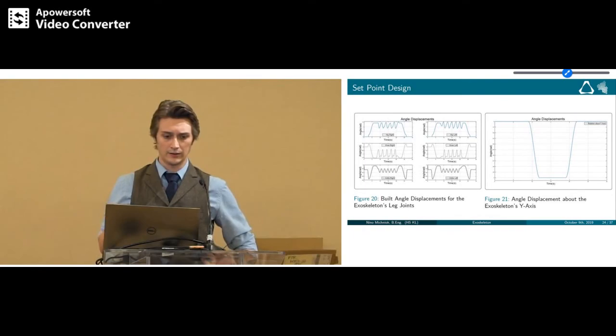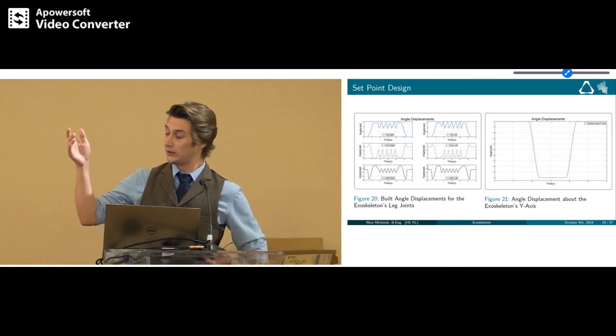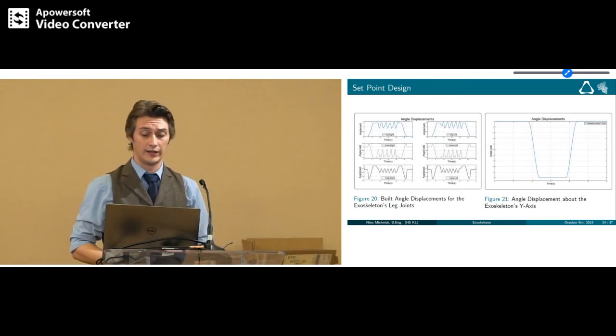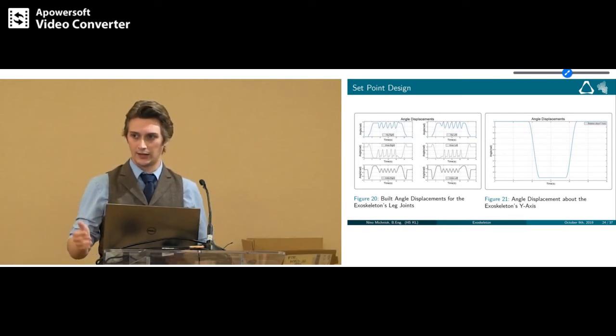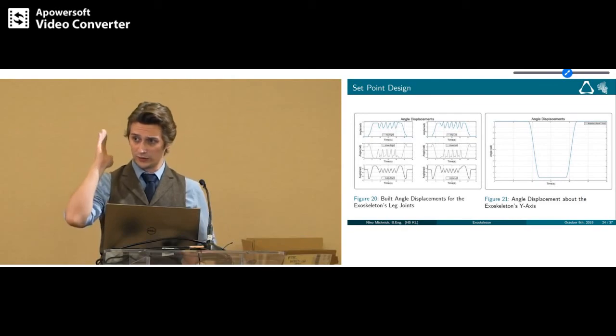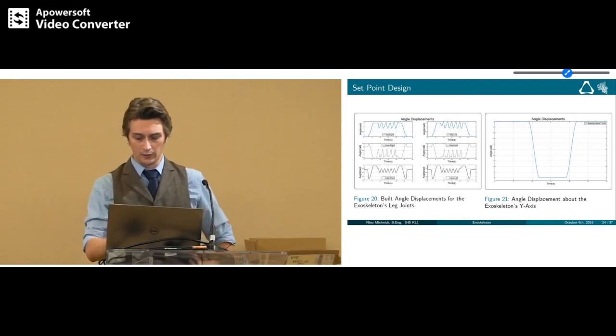And by that, I then added my new set points. Again, the leg angle displacements at the left, consisting of standing up, 5 steps in each leg, sitting down. And the rotation about the y-axis, which is a quick turn to -1 after standing up, stays at -1, so it walks diagonally, returns to 0, so it could sit down looking forward again.